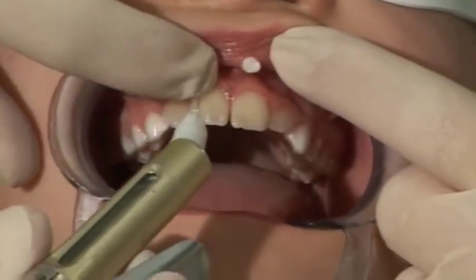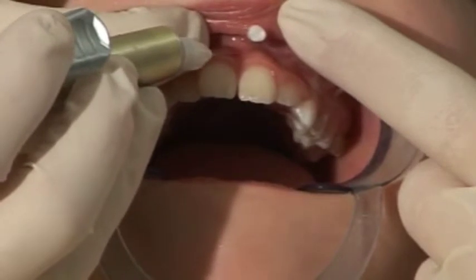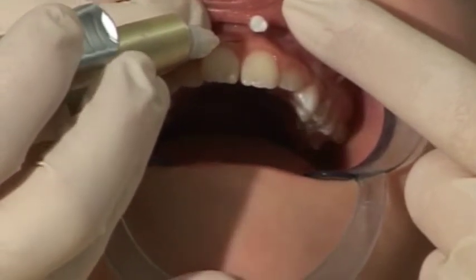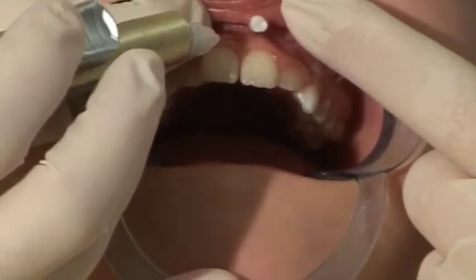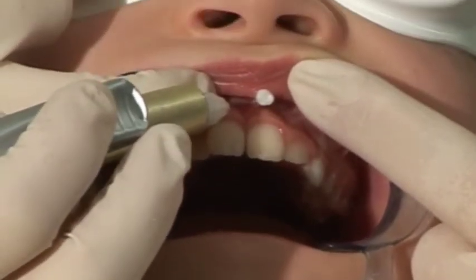Frenulectomy is the removal of the labial frenulum to allow the gap between the front teeth to close. The labial frenulum is anesthetized before starting treatment.